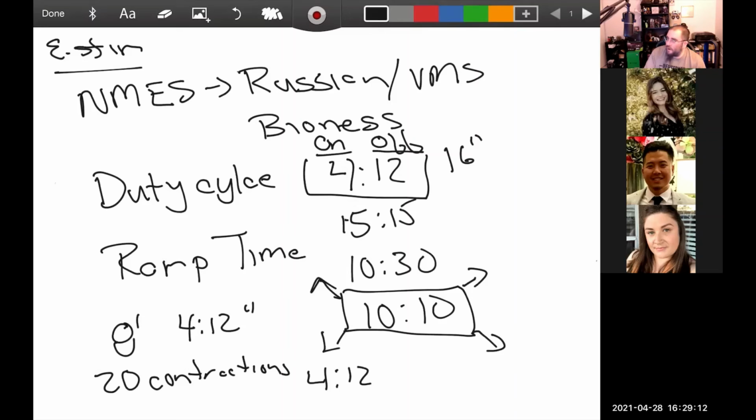Does Russian overall make sense? Are there any questions on Russian you're not understanding about NMES?